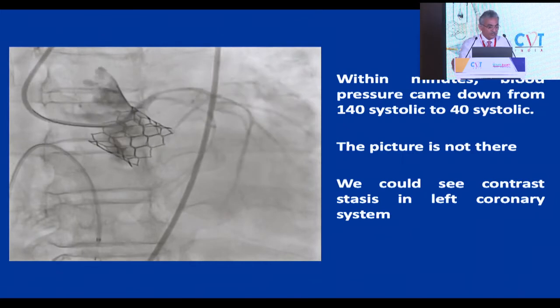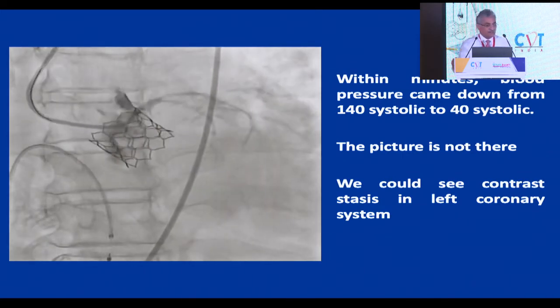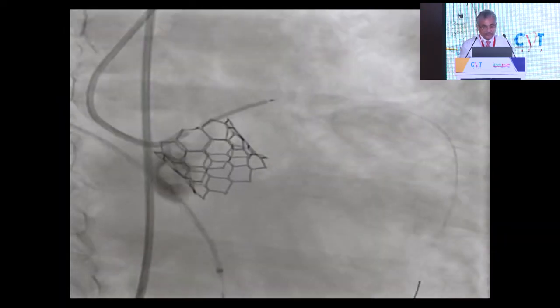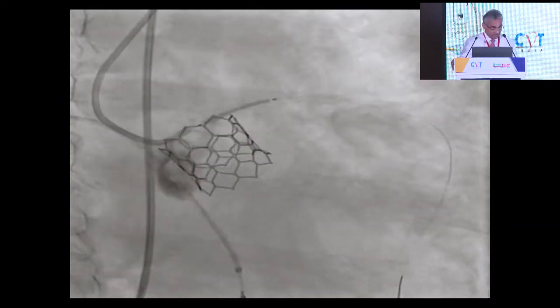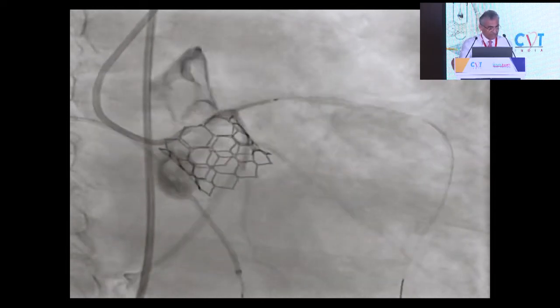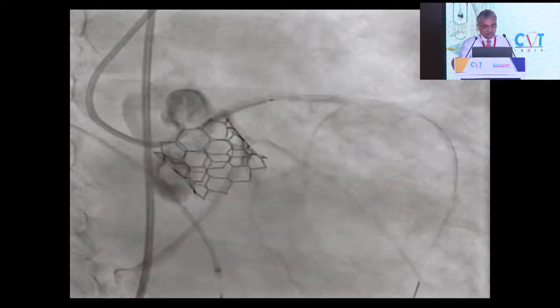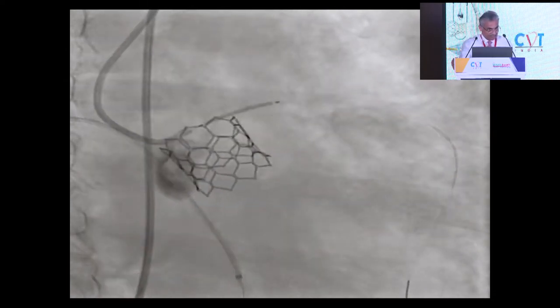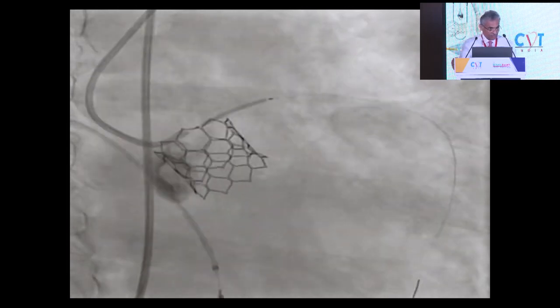And you see, as I'm injecting with the guide and the wire is going up there, you can see some contrast filling the left system. Already the things were in place, and fortunately, God was kind to me on that particular day, we could recross within, I think, maybe a minute's time. As soon as the wire was in, the leaflet which was occluding the coronary moved, and blood started flowing in the coronary artery. The patient came back. The pressure started rising, back to maybe more than 100.